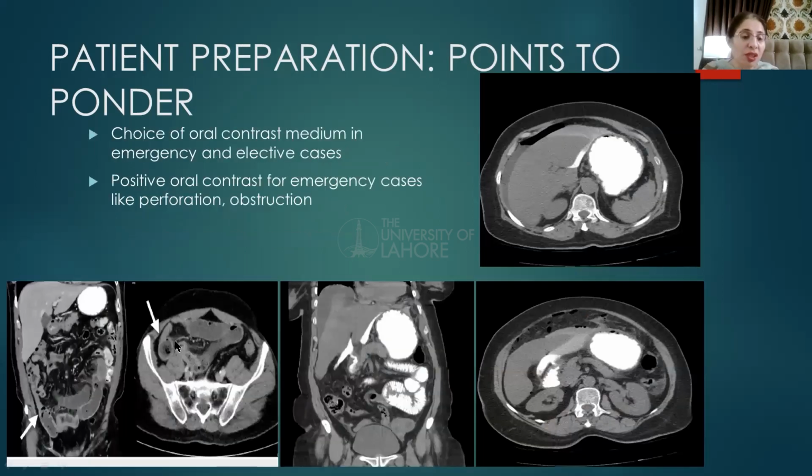Now I come to the interesting topic, the choice of oral contrast medium, positive contrast medium or negative contrast medium. By positive contrast medium, I mean the iodinated water-soluble contrast medium, and by negative, I mean simply water. There is a lot of variation in it. Different people practice differently based on their experience, but it is generally advised that a positive contrast medium can be fairly used in emergency cases like perforations and obstructions.